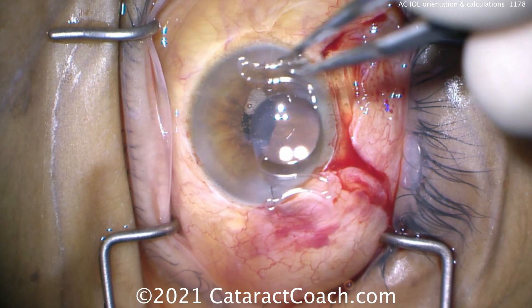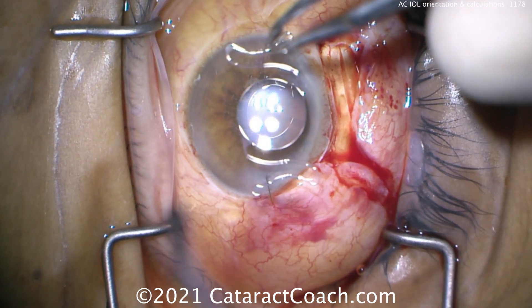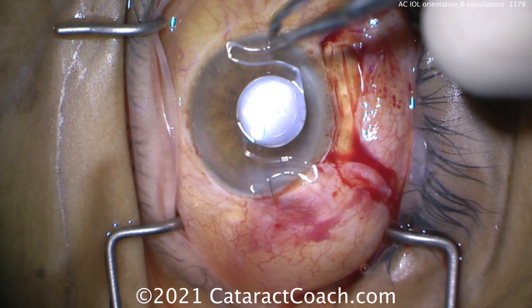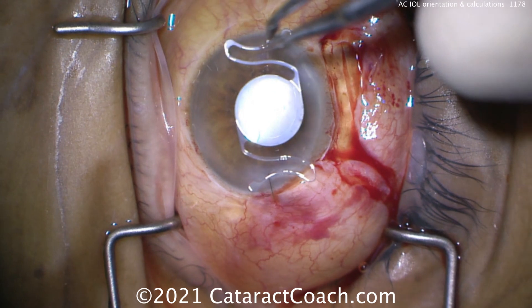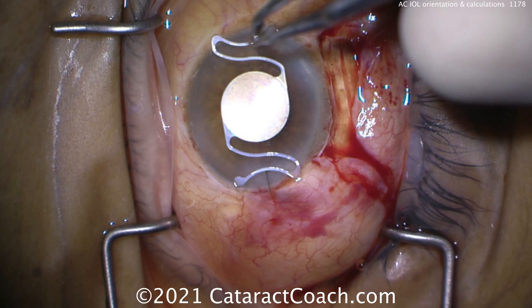There's the lens — that's the correct orientation. And how do you know? Look at the haptic-optic junction. We're showing you the video in slow motion, by the way.